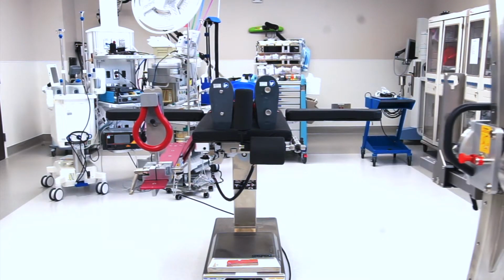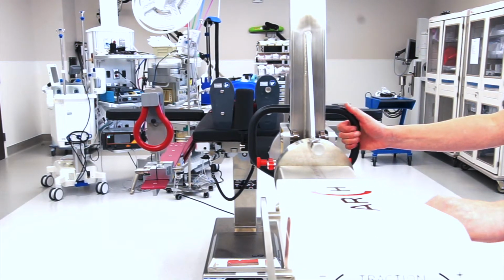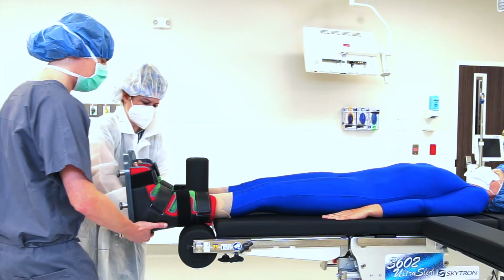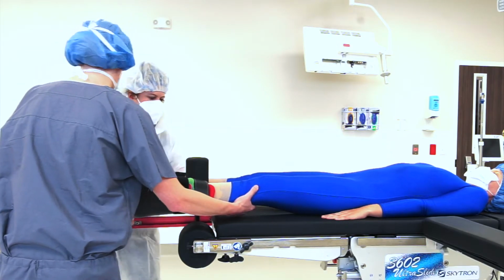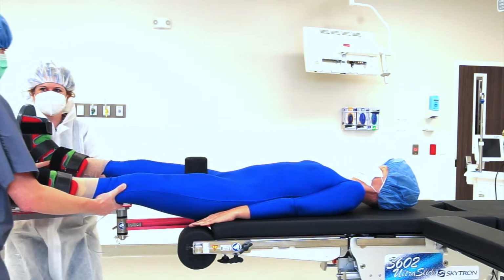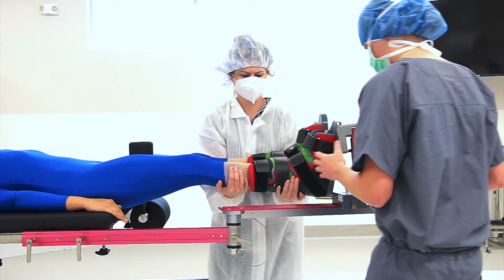Roll the arch into position, aligned with the operative leg. Ensure all surgical functions are set to 0. Pull the patient down toward the perineal post. This is easiest with multiple staff members. Continue pulling until the patient is tight against the post.